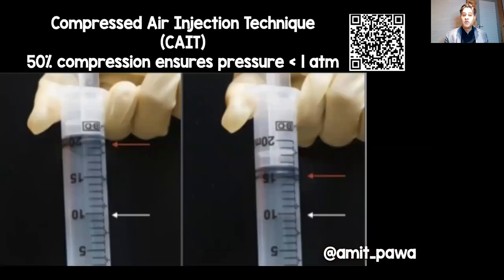But the other thing you could do is to use the compressed air injection technique, which involves putting a column of air above the local anesthetic injectate and compressing that column of air to 50%. So for example, you take a 30 ml syringe and put 20 mls of local anesthetic in and 10 mls of air above it, and you compress the air from 10 mls to 5 mls. What that will mean is that your injection pressure will never exceed 1 atmosphere, which is associated with causing damage when you're performing these techniques.